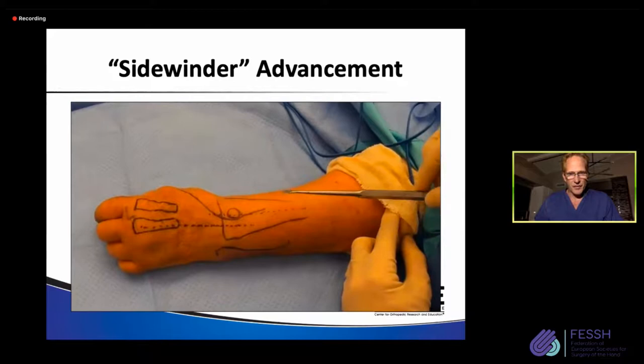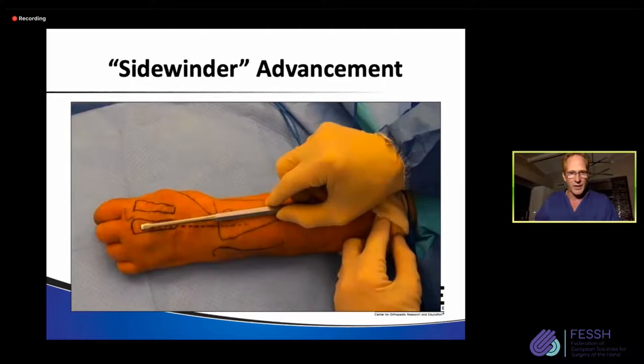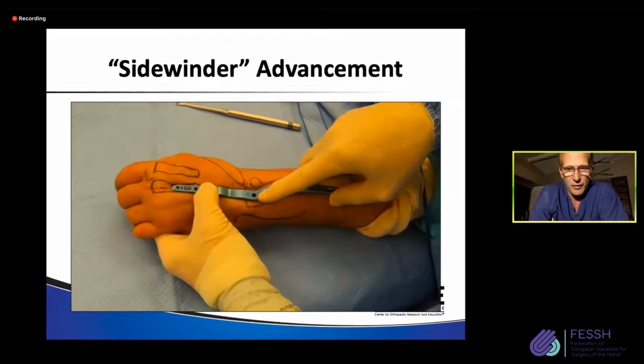If I have a plate that's passing along here, I have to jump over this tubercle, and you can see how I'm just lying right over EPL, and that's why this is a potential complication of this technique. Medartis solved this problem by creating a plate that avoids this problem. So now what happens is it sits on the third metacarpal, runs around Lister's tubercle, does not get involved with EPL at all, and then finds the axis of the radius appropriately.